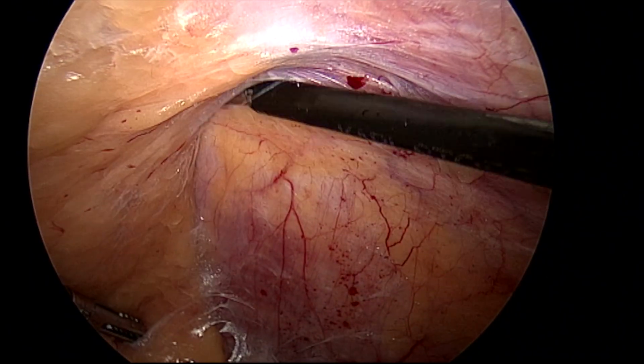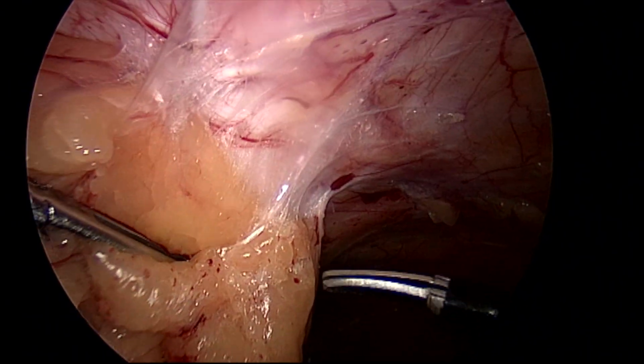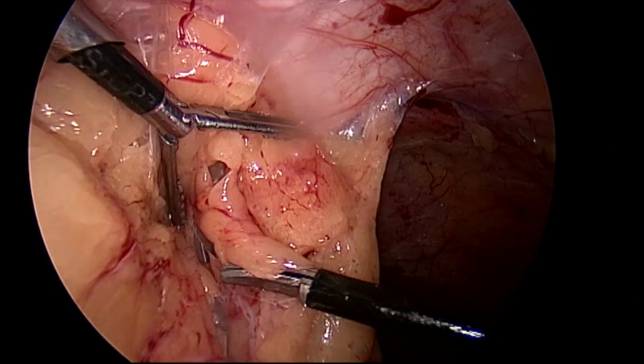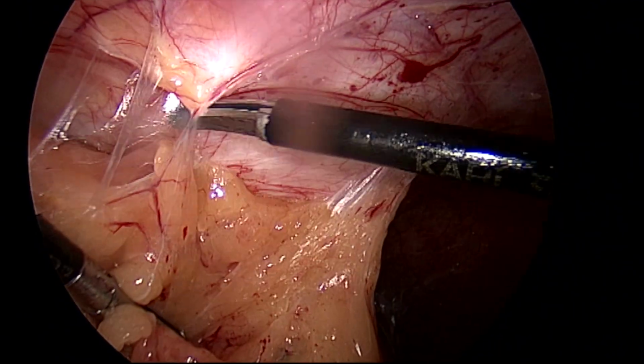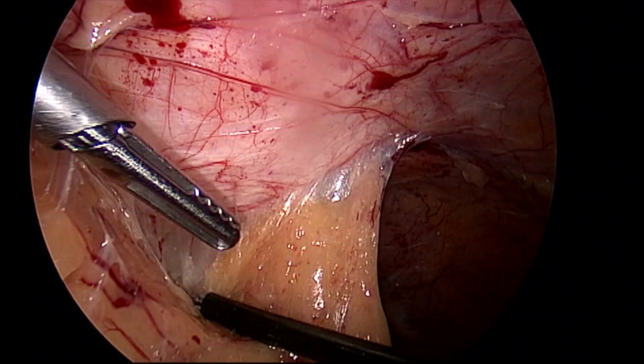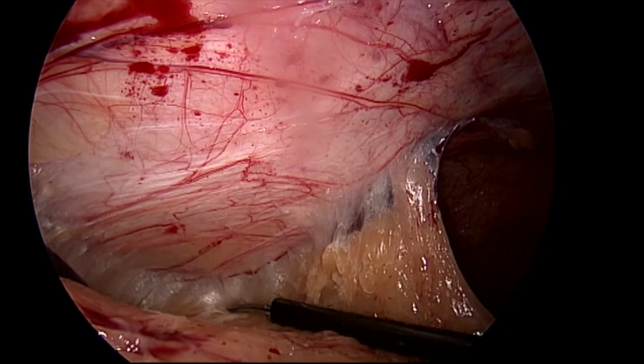So now I'm entering the right side, where I'm showing with the scissor. So from the left side to the right side I'm entering now. This patient had a divarication of recti also. You can see the widened linea alba, the white color. So all the adhesions are being released.